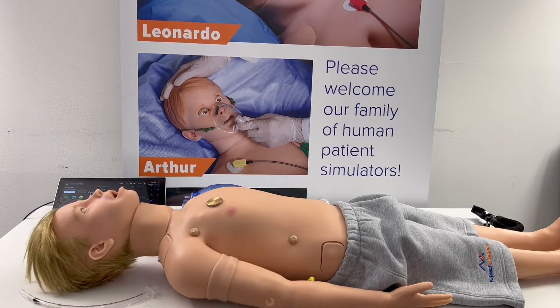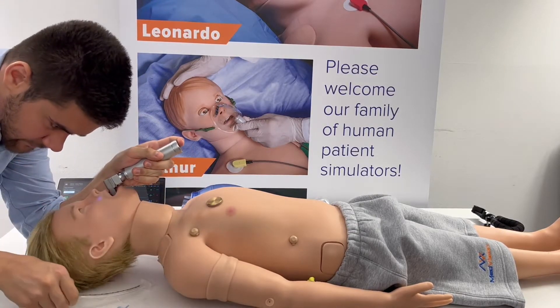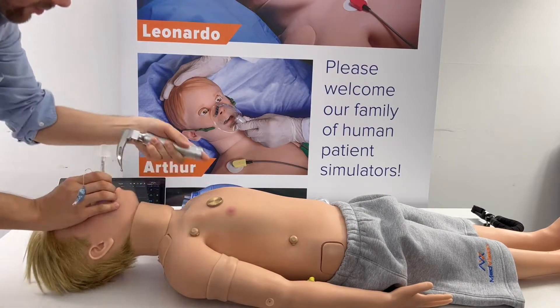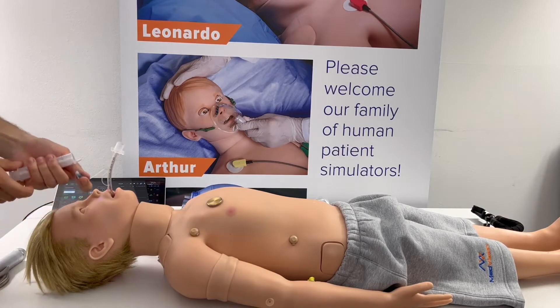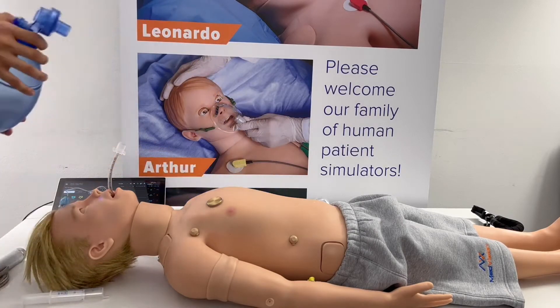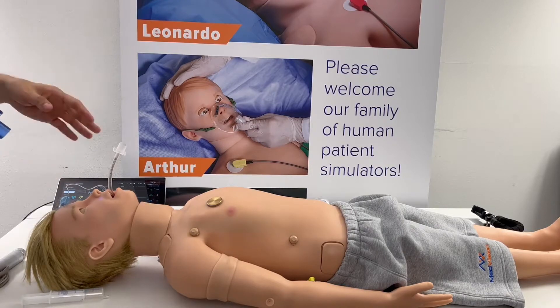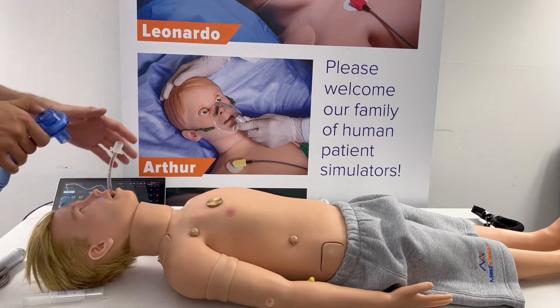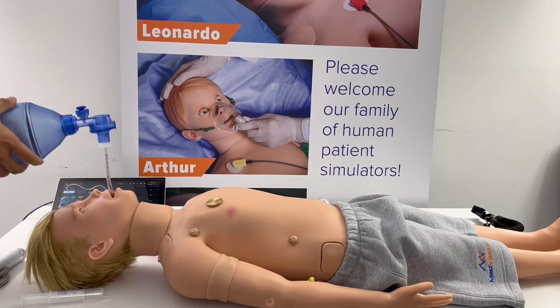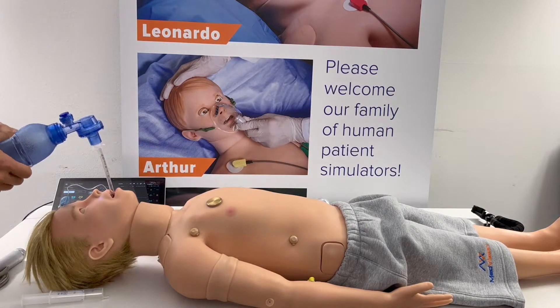Now I want to show the new stomach distension feature. I'm going to intubate Arthur into the stomach — Med Vision mannequins are quite easy to intubate when done correctly. I have intubated him into the esophagus with the stomach distension feature on, and I'm going to start ventilating. You can see the stomach rise — the bags for the stomach keep inflating but will not deflate. There it is — the stomach is now distended.